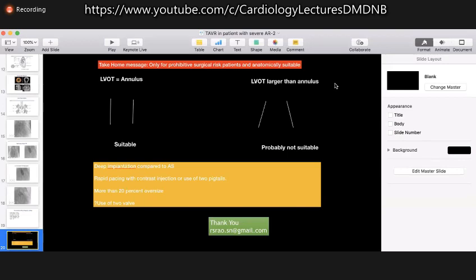But with the balloon expandable valve, I was able to make the entire contact from LVOT to the annular plane in one plane. So, as of now, if you ask me, with very little experience, I would still choose a balloon expandable valve if the anatomy is suitable. Maybe we can have some input from Dr. Sigitas as well. Yeah, so that's a really great case.